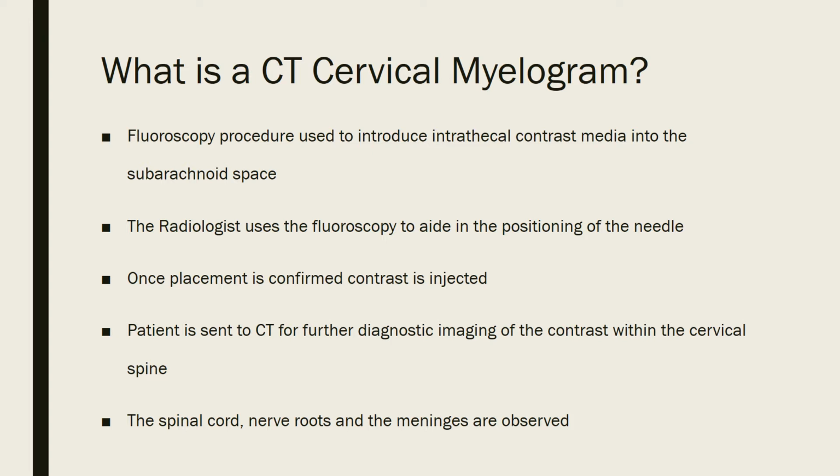They will work with the radiologist, who will use live x-ray to help aid in the process of introducing contrast media into the spinal canal. The contrast used must be for intrathecal use, since we are injecting into the subarachnoid space.